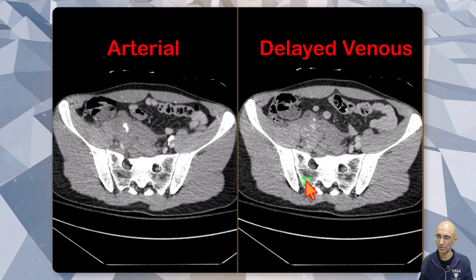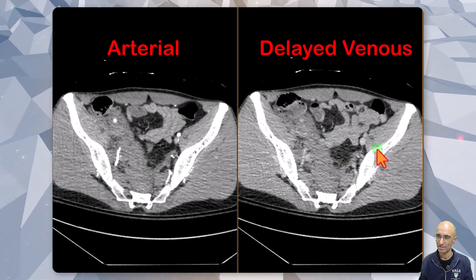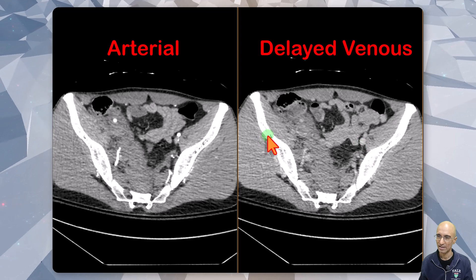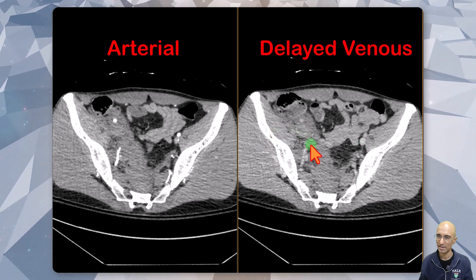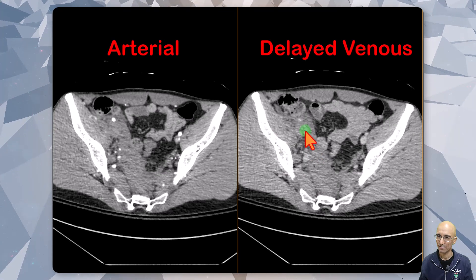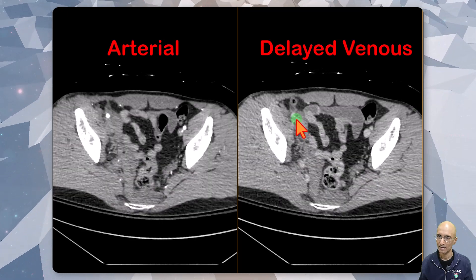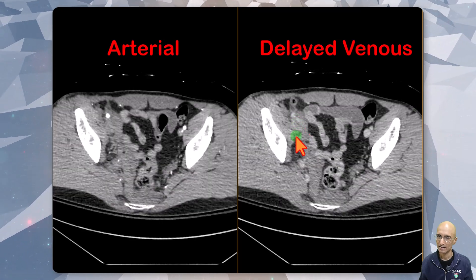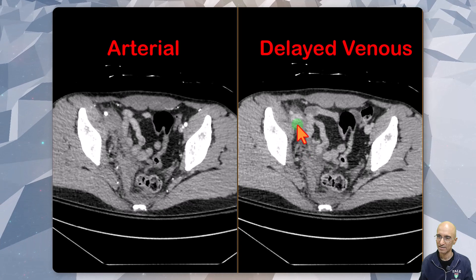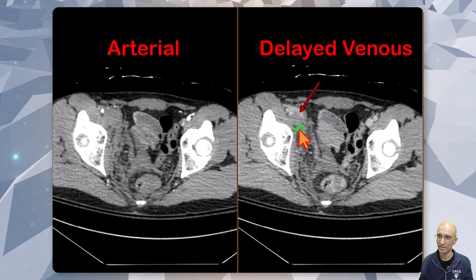As I keep scrolling down further on the delayed venous phase, we can see the normal left external iliac vein but no right external iliac vein is identified. We can see a filling defect in the right external iliac vein which extends into the distended right common femoral vein.